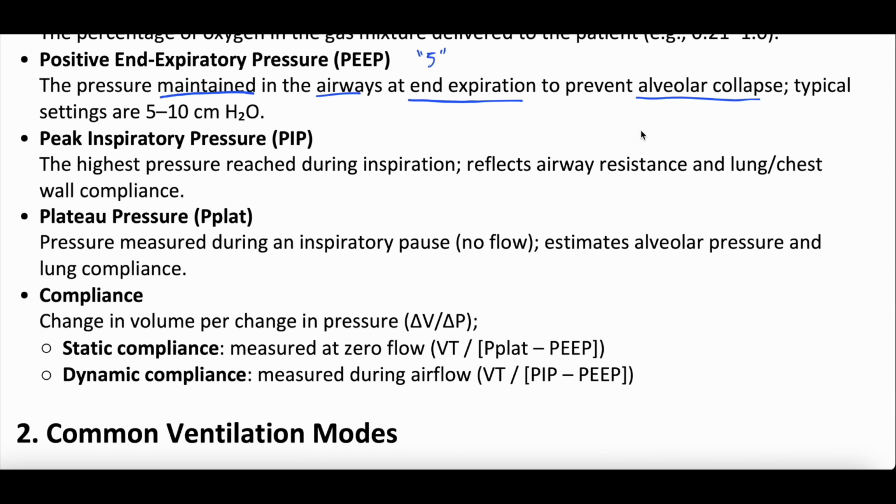All right, because if the PEEP went to 0, if there was no pressure and you let a patient fully exhale all of the air out of their lungs, well, whatever their exhalation volume is, we should say, and there's no pressure left, those alveoli would collapse. And then when you push a breath back in, those alveoli will be kind of ripped back open, and it can lead to something called atelectatrauma. Atelectasis being that collapse of the lungs, atelectatrauma being what can happen if you have too much alveolar collapse and reinflation, collapse, reinflation, collapse, reinflation.